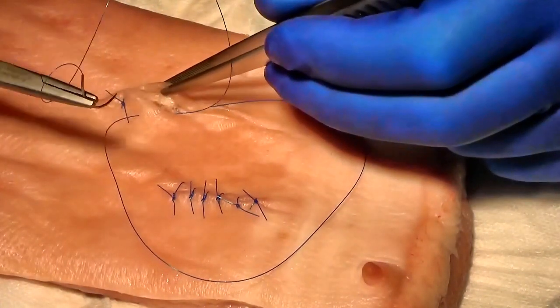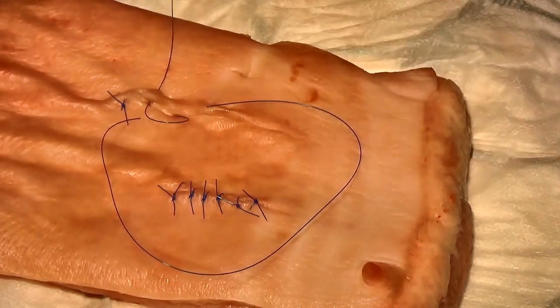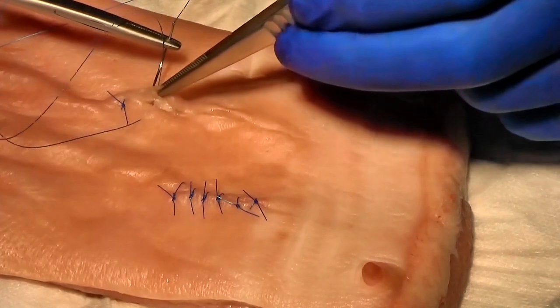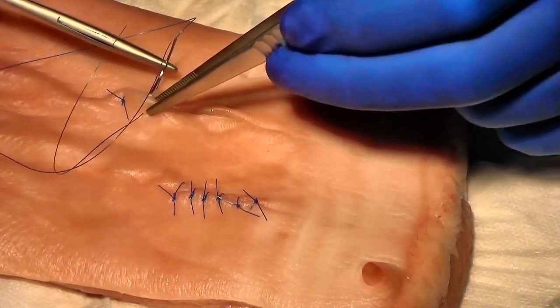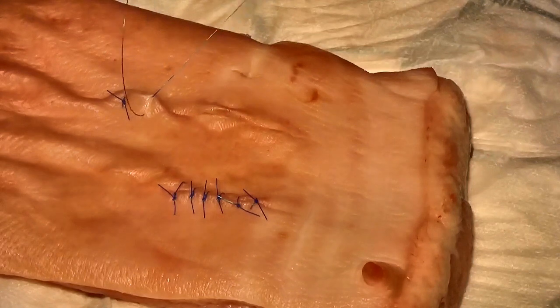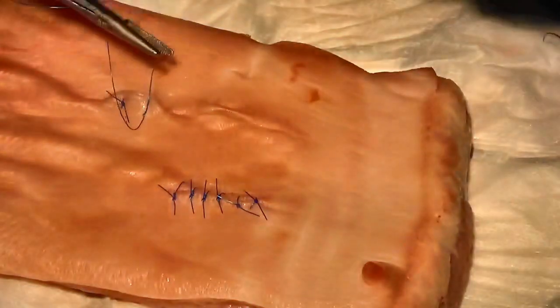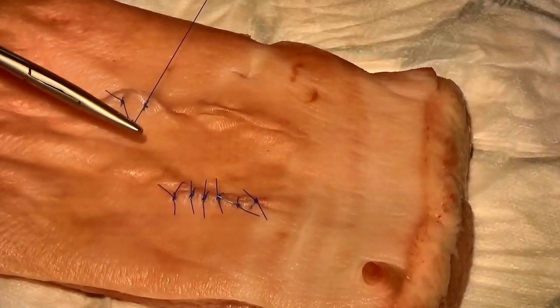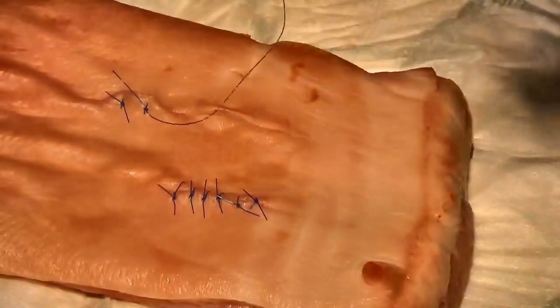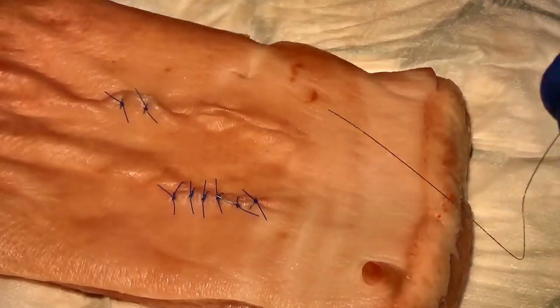And again on the other side. So that's 2 sutures completed.